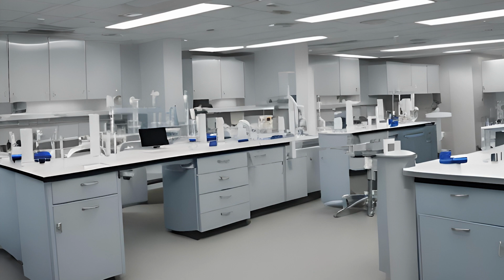If that happens, blood will travel up through the open lumen of the needle, and instead of going into your tube, it will squirt out the gap between the patient's skin and the needle, and it will fountain into the air. It will literally make a blood fountain into the air. So you have to do this in one smooth motion.